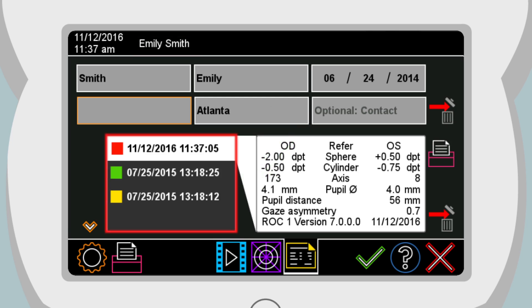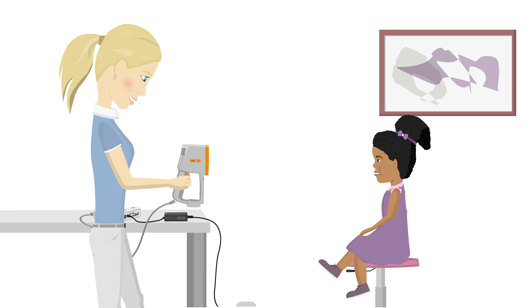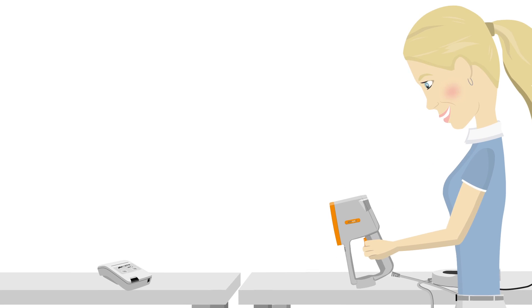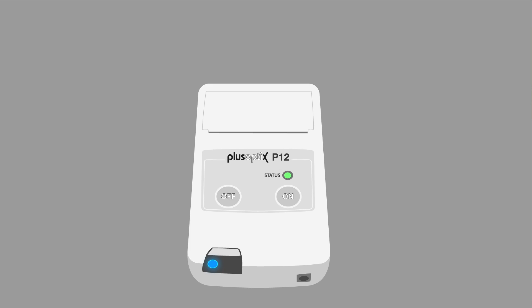If there are already saved measurement results for that patient, they are now shown in the overview. Simply hold the measurement device of your PlusOptics device directed towards the label printer PlusOptics P12 to print a self-adhesive label.